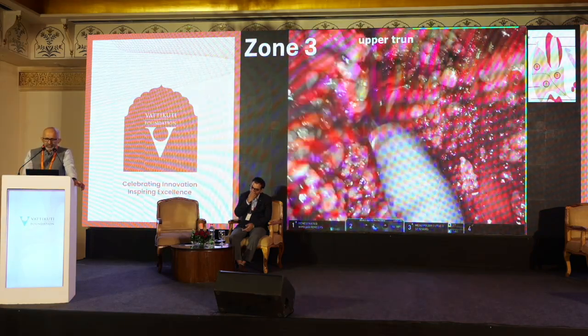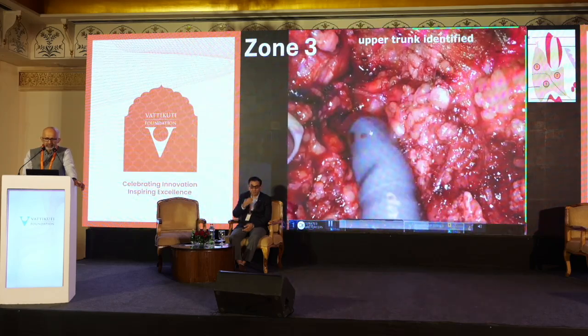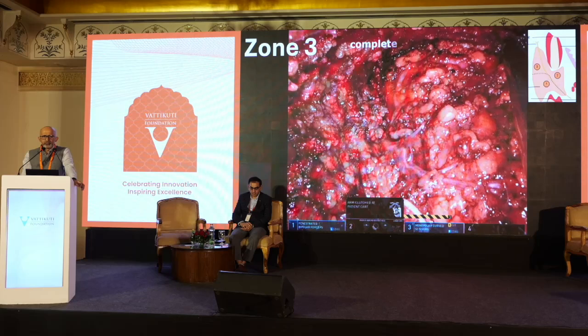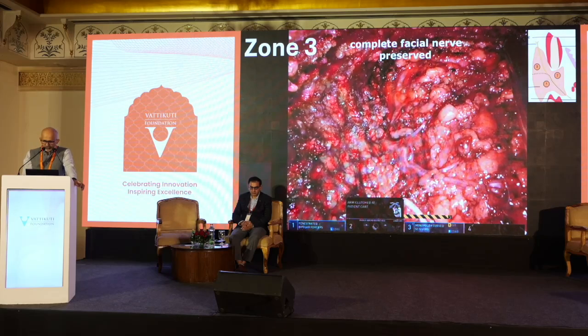That is the facial nerve which you are seeing here. These are the rootlets of it. This is the upper branch or upper trunk which is going towards the ear. That's a very important branch to preserve. So this is all the 5 branches clearly shown.